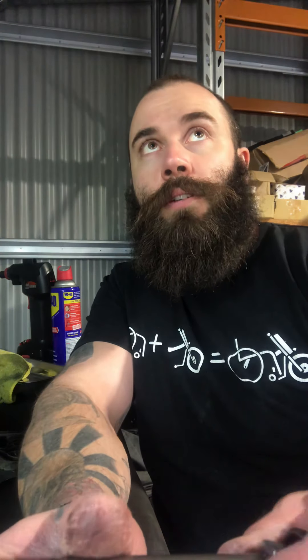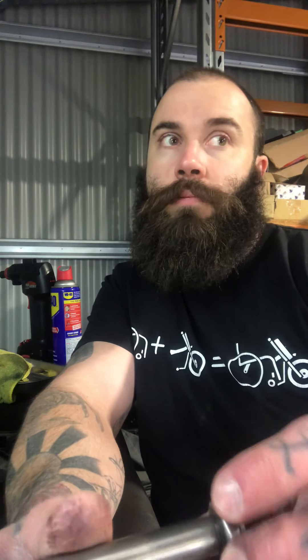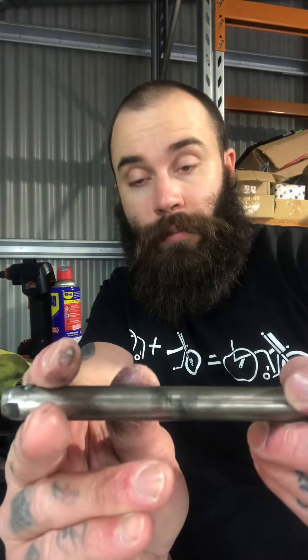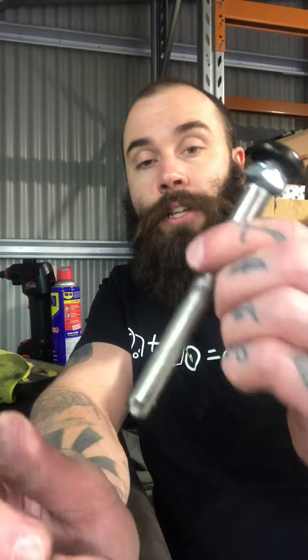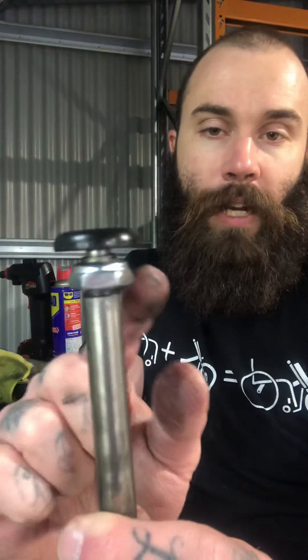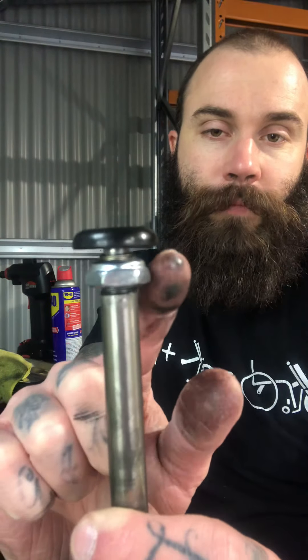But sometimes on the other hand, what happens is the axle will have too much play in it, which means it will be wound too far in basically. And that means you've got a lot of back and forth motion. Now the way to fix that — I'll show you in a minute — is basically what you want to do is you've got a nut up here. So there's the nut.